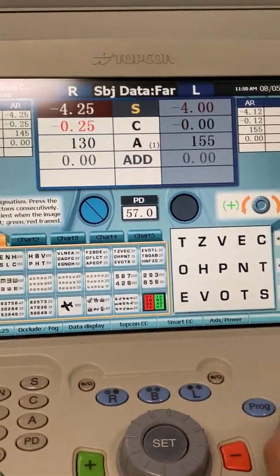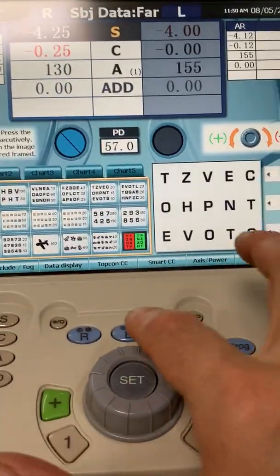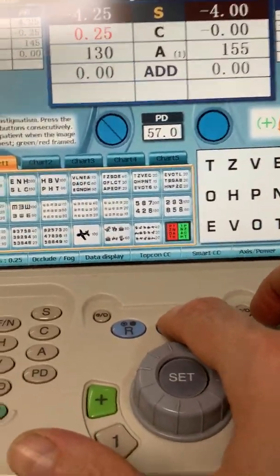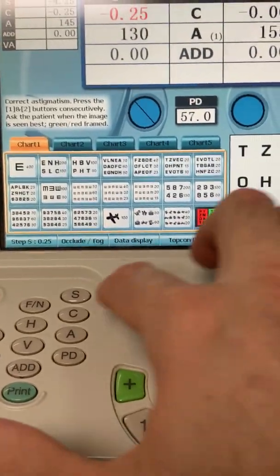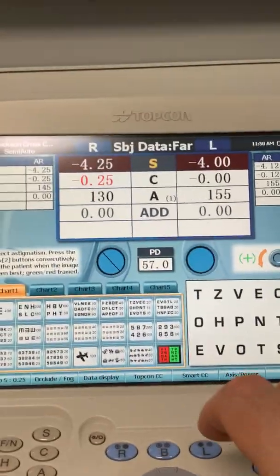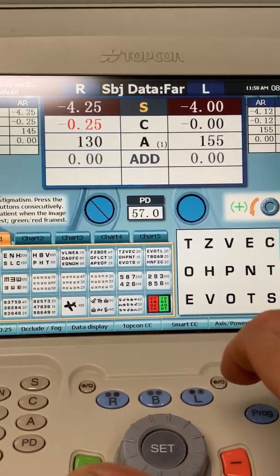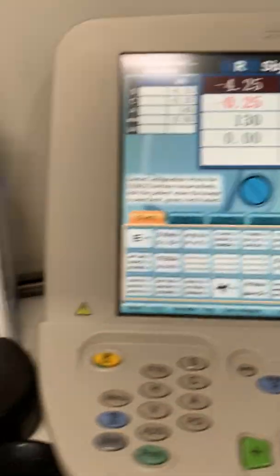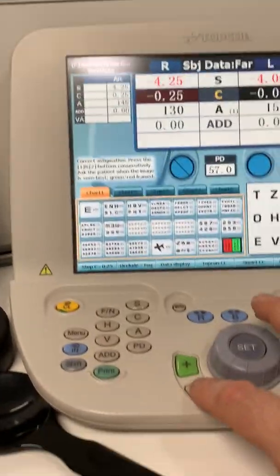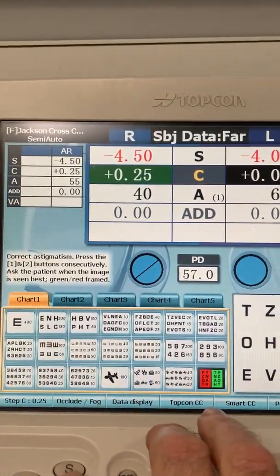Sometimes weird things can occur with this equipment. If we're trying to get both eyes open, we hit the B button, but sometimes they don't both open up. Sometimes we have to hit B, then S for spherical power, then B a second time, and they both open up — that's just a little anomaly. Also, sometimes when working with cylinder power, if you hold down the cylinder button too long, it switches to plus cylinder form.